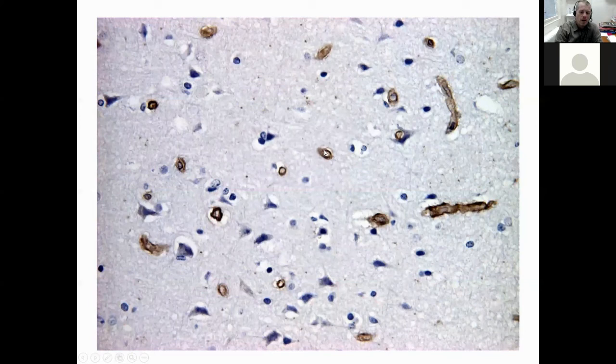And my last picture is from the brain. You can tell it because you can see the triangular shape of the pyramidal neurons here from the brain cortex, either from the third or from the fifth layer. We don't see the context. But if you remember, we have told that these are the continuous type of capillaries. They have a continuous basal lamina, and the structure that looks brown here is a specific detection of laminin, which is one of the glycoproteins of the basal lamina. So you really can see a nice circle around every capillary, and you can get the impression how dense the capillary network in our brain cortex is. All the brown structures are brain capillaries of the human brain.